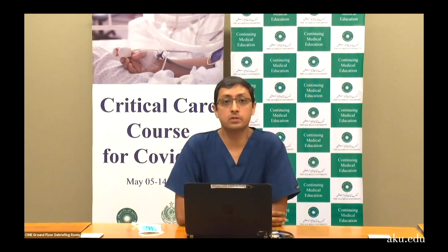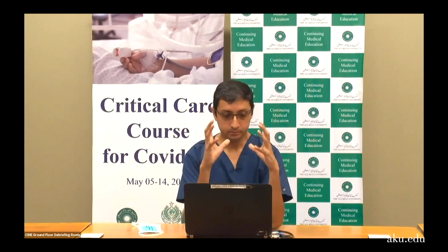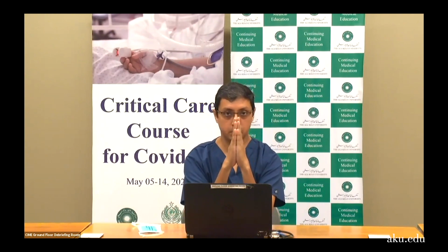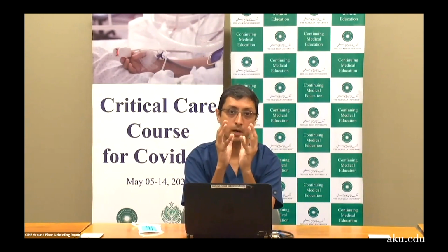Right, PEEP stands for positive end expiratory pressure. How does it work? Okay, so you look at a balloon. An alveoli is like a balloon. If the balloon collapses, it becomes very sticky, and then it becomes very difficult for it to expand again. What PEEP does is prevent the alveoli from collapsing. It keeps them up a bit high. It keeps them open and prevents them from collapsing.